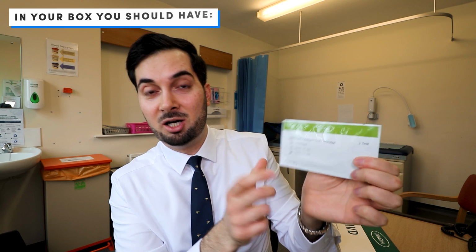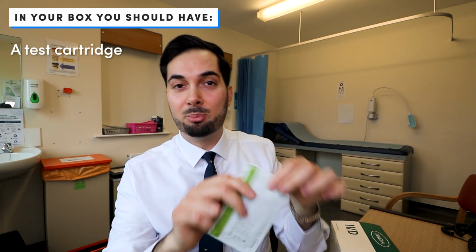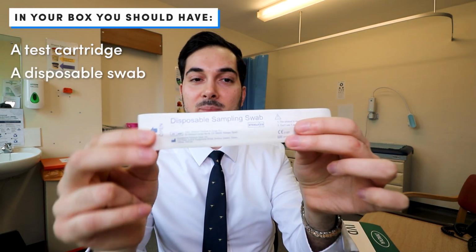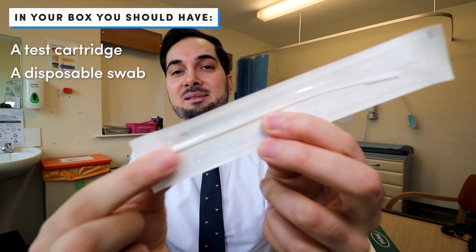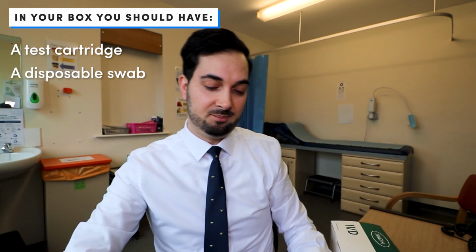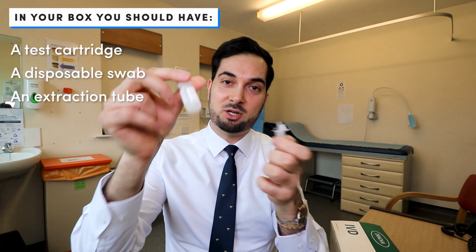So within your kit, you should expect the following. So first of all, you're going to have the COVID-19 test cartridge. The thing that I showed you earlier, it comes in a thing like this. You cut it open and it's within there. You also got a disposable testing swab, okay? We've all seen these before, I think, I hope you have. So it's got a little plastic handle there, and it's got the little fabric bit at the end that you use for testing. Next up, we've got the extraction tube, and we've also got the extraction solution.